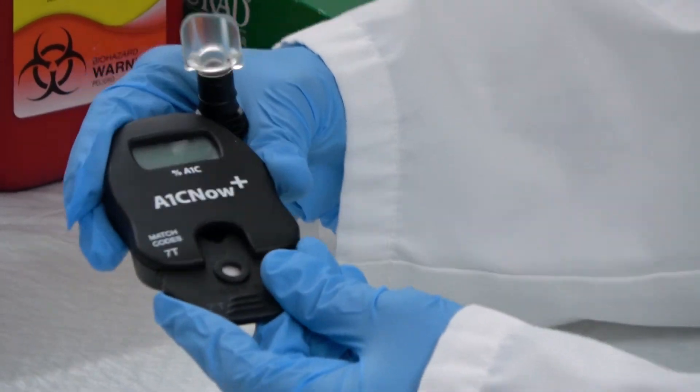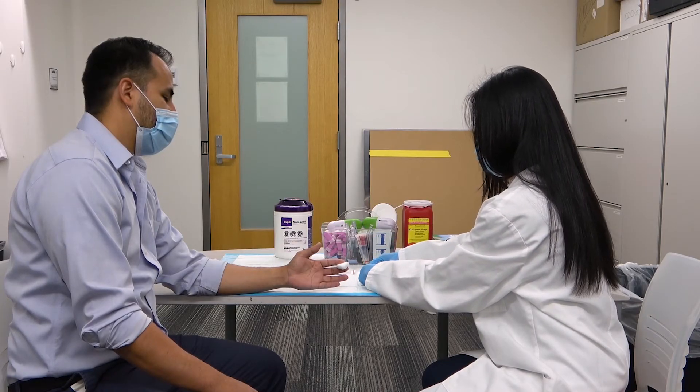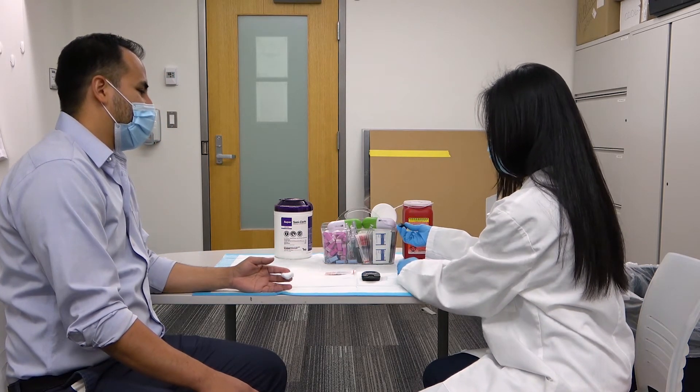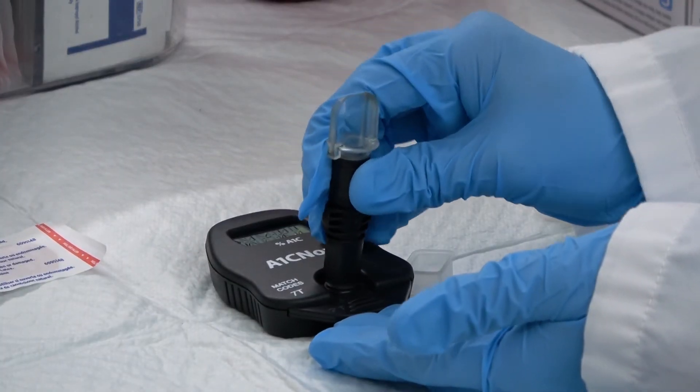Insert the cartridge into the A1C meter. Remove the dilution sample cap and insert the plunger into the provided area, ensuring to click.